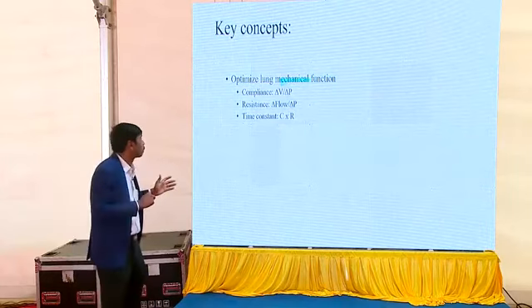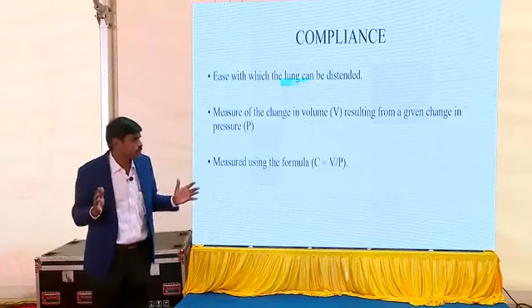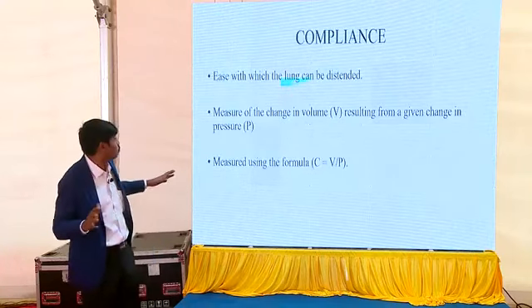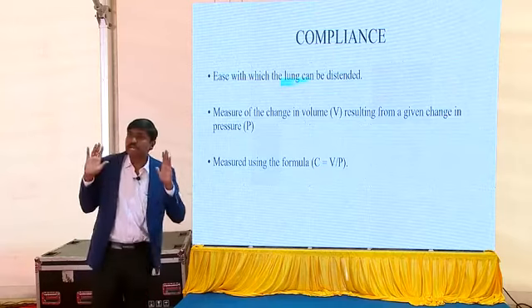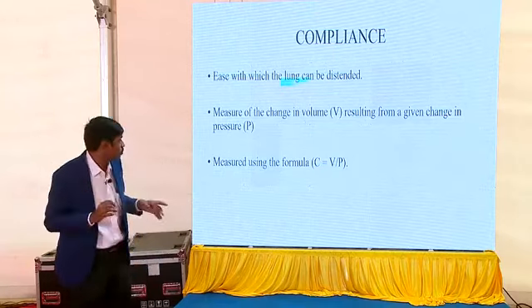Yeah, next one, ma. So again, from an academic point of view, there are two types of compliance. One is called the static compliance, another is called dynamic compliance. Yeah, next one.